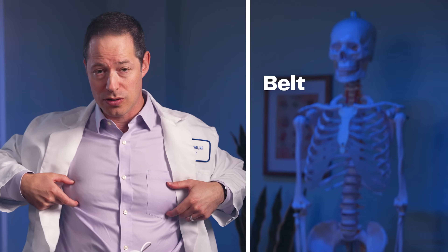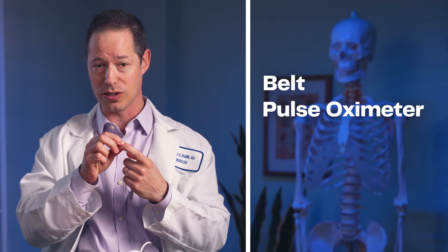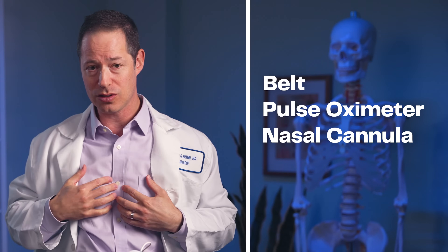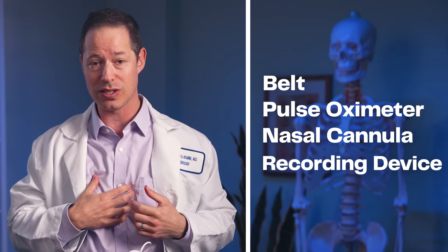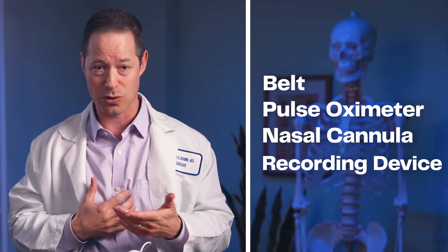The WatchPat 1 is an example of a type 4 home sleep apnea test device. Another example would be the Night Owl. What are the other options out there that you might get prescribed? The traditional home sleep apnea tests have a belt across your chest, a pulse oximeter that measures your oxygen levels, a nasal cannula that measures airflow, and then something to record the data — generally sitting on the belt — which also typically records body position.